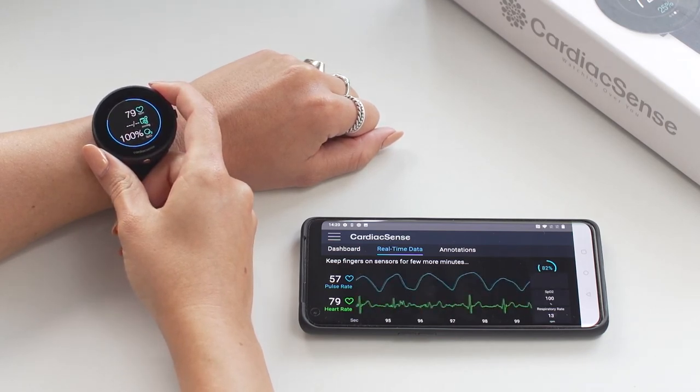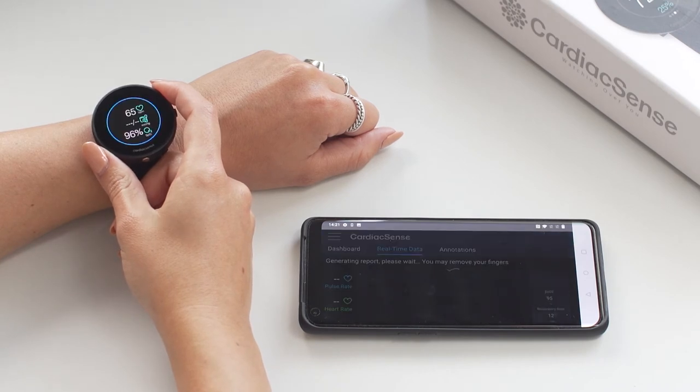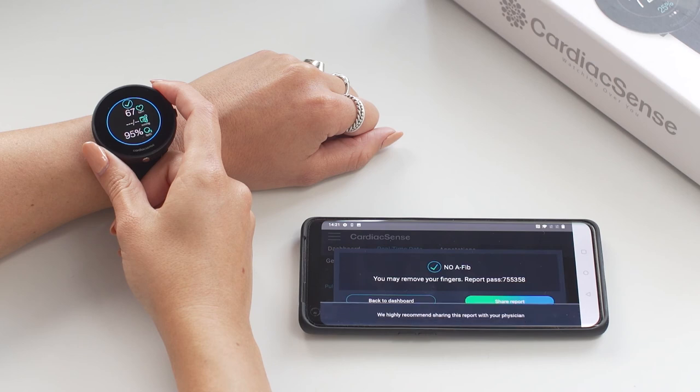Once the measurement is complete, a pop-up message appears on the screen, notifying whether AFib was detected or not and that you may remove your fingers.